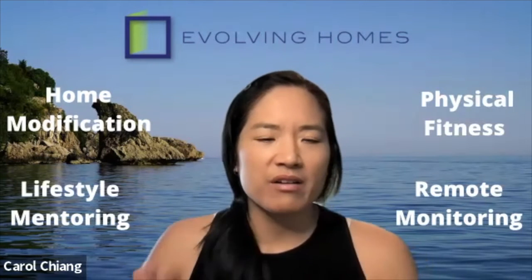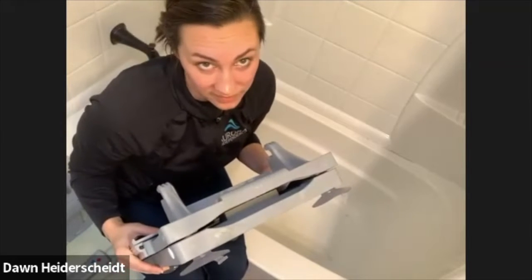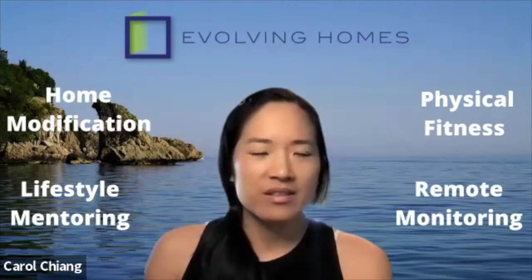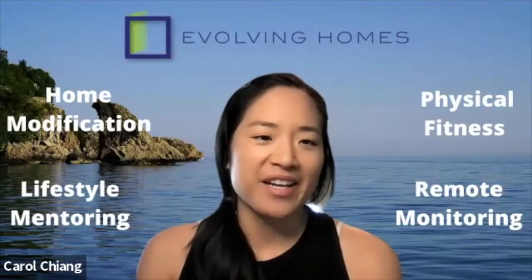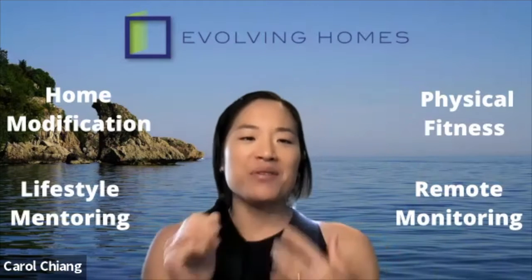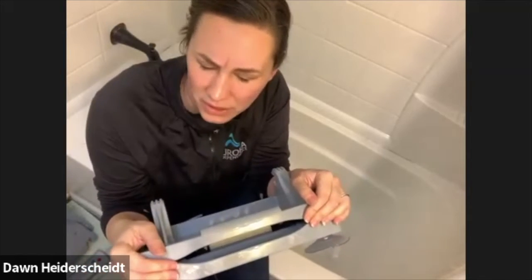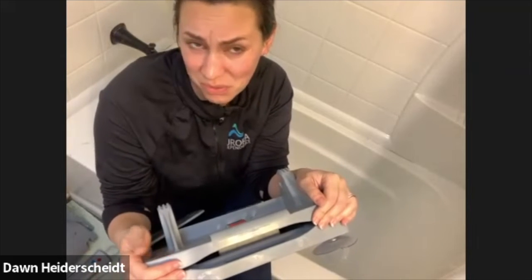Does it come with a case, some way to bring it? I believe you might be able to purchase one, but it does not come with one when you first purchase it — I'm sure there's an accessory available. After that, you can carry it one hand here and the other hand on the back of the chair lift, and there you go. I've actually never looked into the case because most of the people I've given it to aren't going to be using it anywhere else — they're kind of homebound.